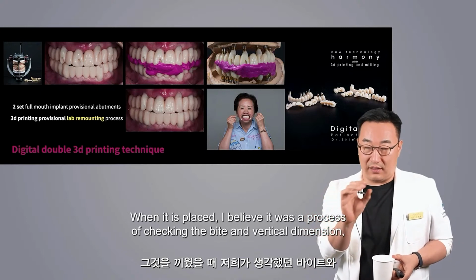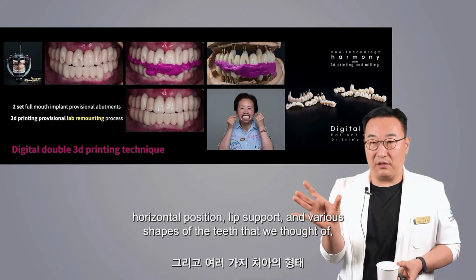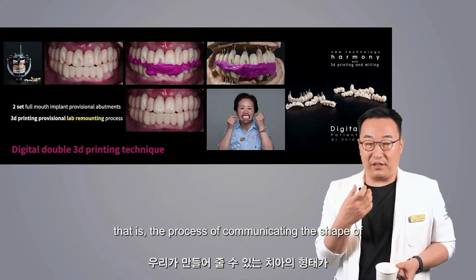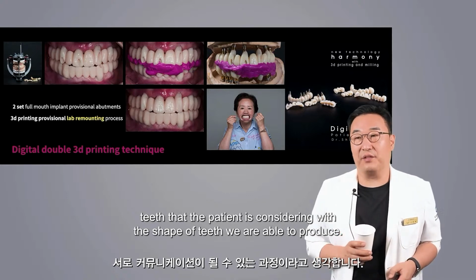When it is placed, I believe it was a process of checking the bite and vertical dimension, horizontal position, lip support, and various shapes of the teeth that we thought of. That is, the process of communicating the shape of teeth that the patient is considering with the shape of teeth we are able to produce.